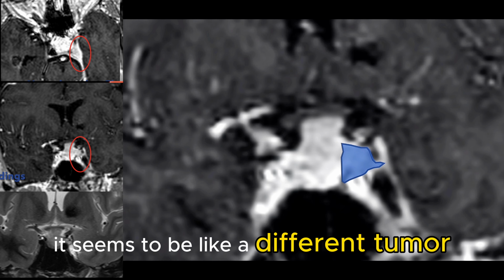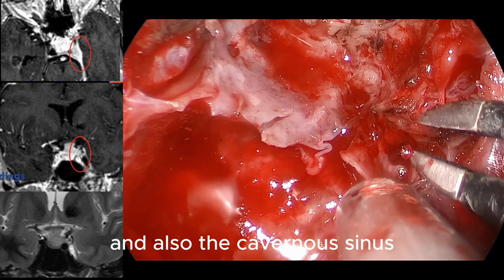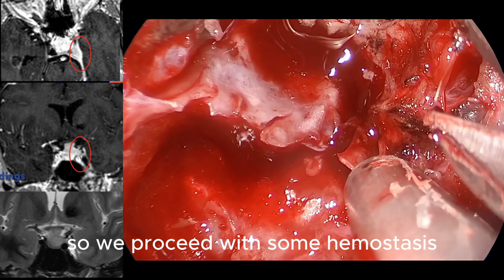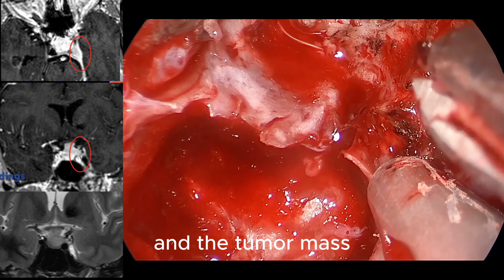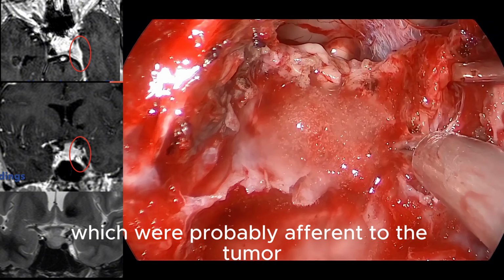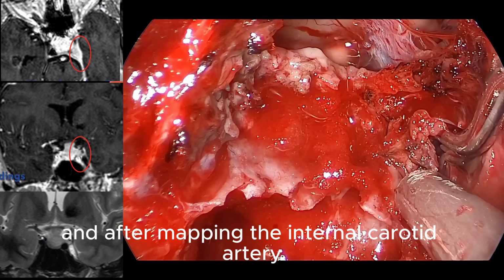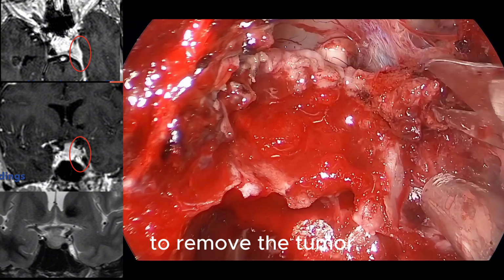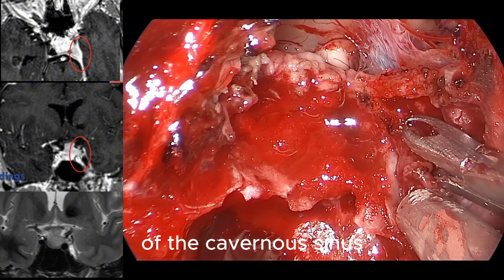It seems to be like a different tumor, but it was the same tumor invading the tuberculum sellae and also the cavernous sinus. So we proceed with some hemostasis between the carotid artery and the tumor mass, which were probably afferents to the tumor. And after mapping the internal carotid artery, we proceed with sharp dissection to remove the tumor from the posterior and superior compartment of the cavernous sinus.